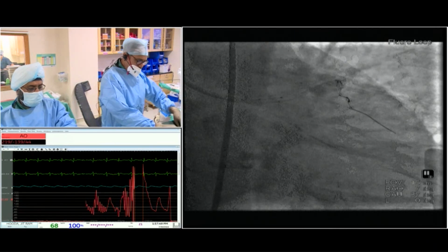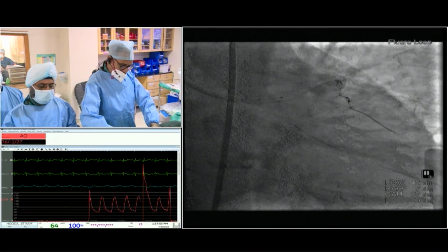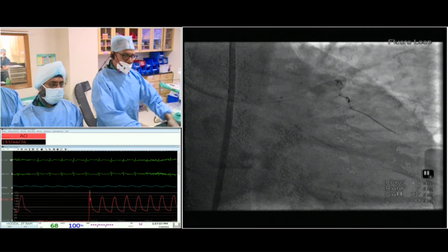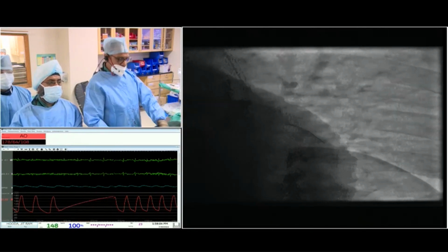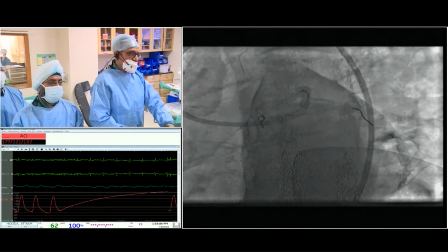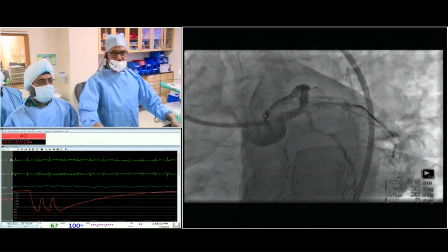And did you see the IVUS runs, Dr. Srinivas? Before one where we have seen, now I think post left main stent you will do an IVUS run. Before and after rota, yeah. Okay. So go to spider. So I take a check shoot here and then recross into the ramus, which fortunately for me is flowing nicely. Give me another wire. So give me a Pilot 50.